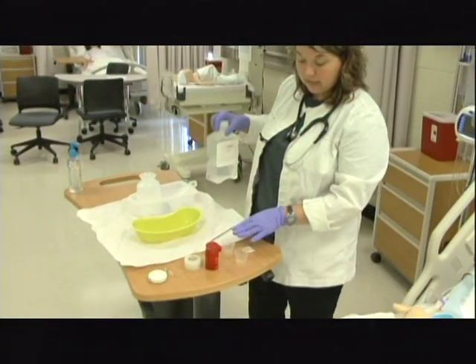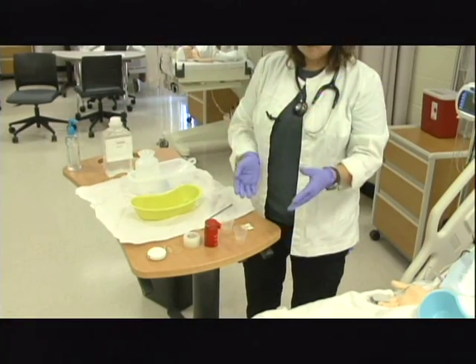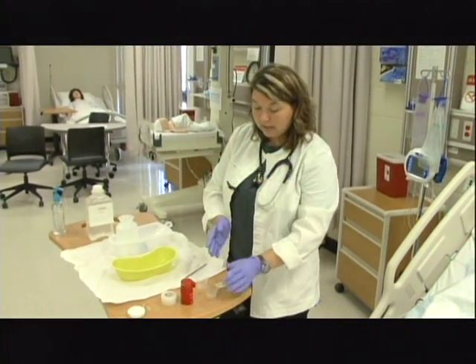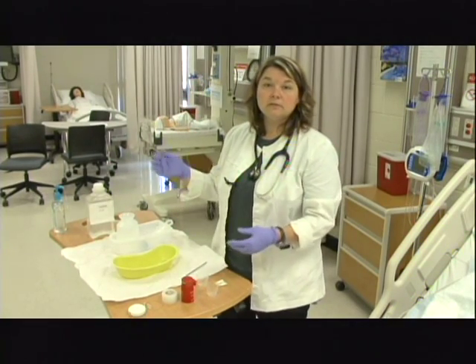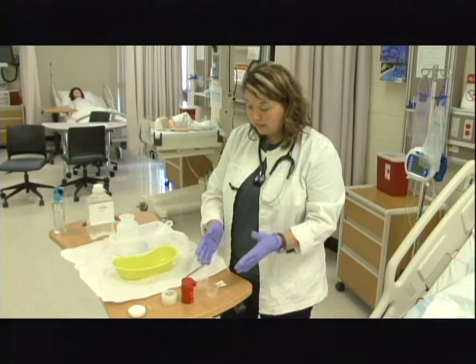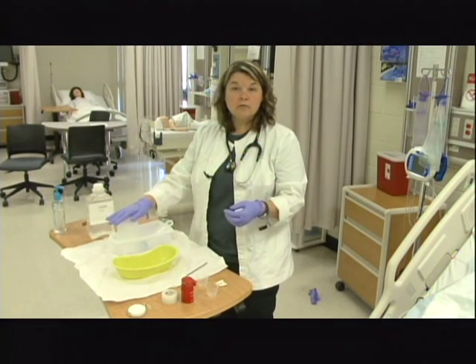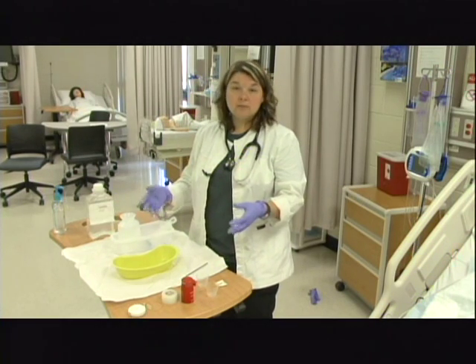Anytime I have the medications crushed, I then need to add whatever I'm supposed to mix them with, up to a 10 milliliter amount. Each medication must be mixed with 10 milliliters of whatever the solution is. I've got my medications prepared. I also need to make sure that I've got the irrigant or whatever I'm flushing with in the container, and I need to have enough of that as I'm going through.